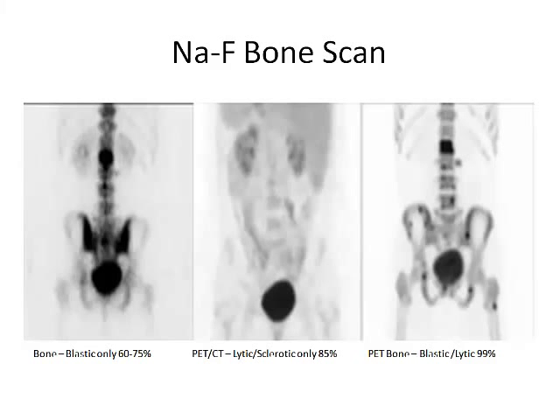Well, PET-CT, nothing. Completely normal PET-CT. With sodium fluoride, you also pick up this lesion, this lesion, this lesion, this lesion, and this lesion. So this is an example where, before 2013, this patient would only have had external beam radiation, period. Nothing else. Using sodium fluoride in this patient excludes him. Now they would probably do it if this was horribly painful, but this will move this patient on to other disease treatments.